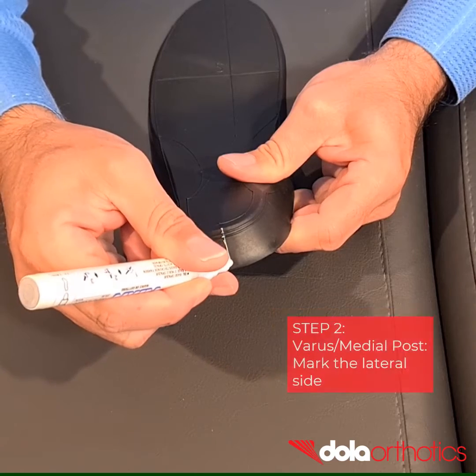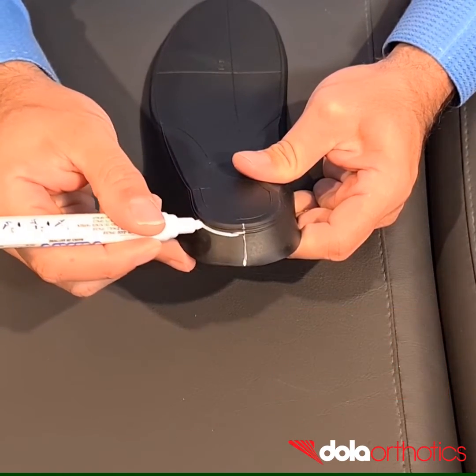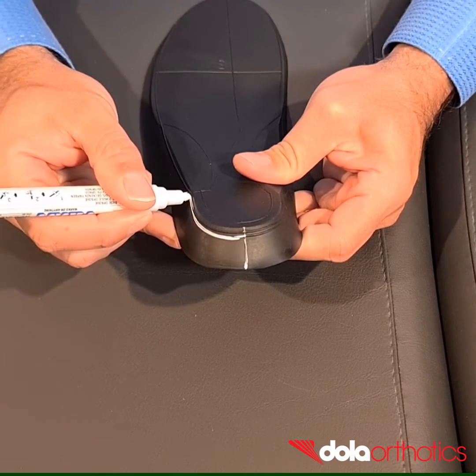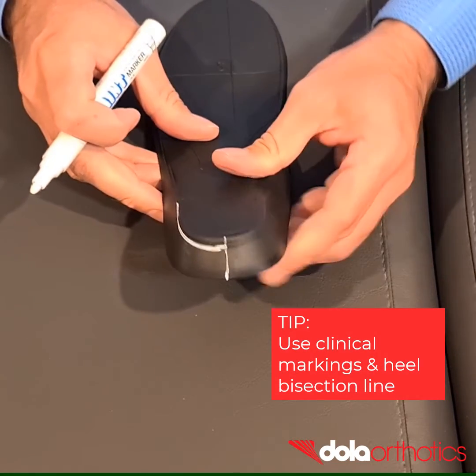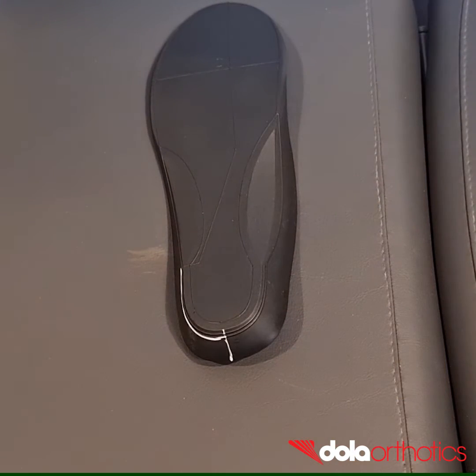Step 2. For a Varus or medial Rearfoot post, mark a point or line on the lateral side of the heel cup. Use the mild or moderate clinical markings or use a protractor to measure and mark your required angle. You now have your angle marked as a guideline for grinding.